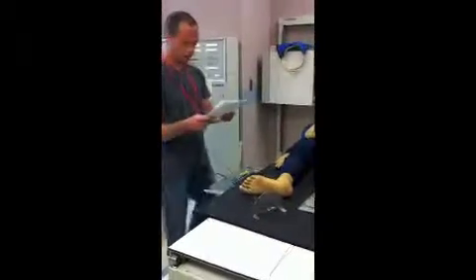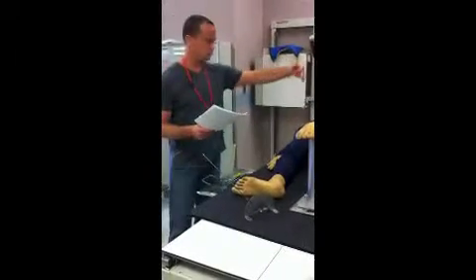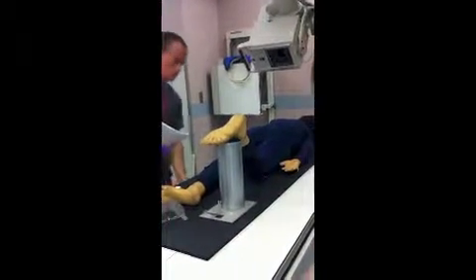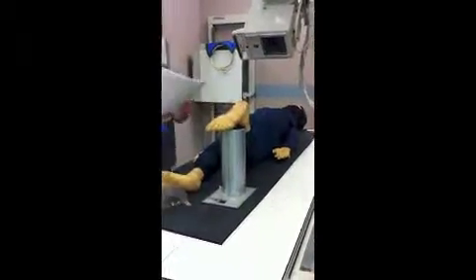Upper half of the knee joint to the IR. The angulation projects the joint to the center of the IR. You also want to make sure that there is no rotation of the knee. I've double checked, there isn't.